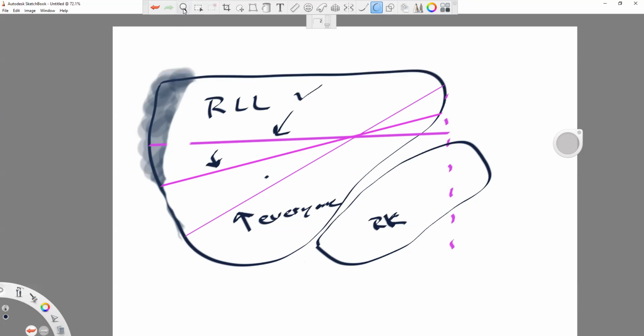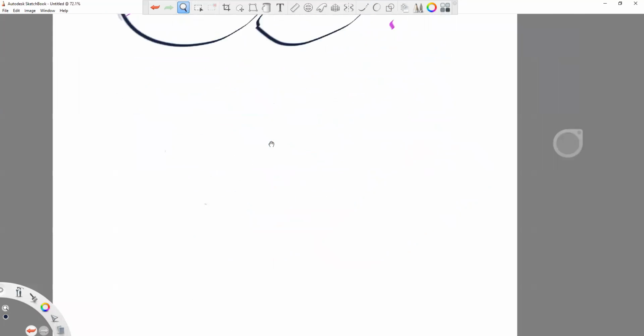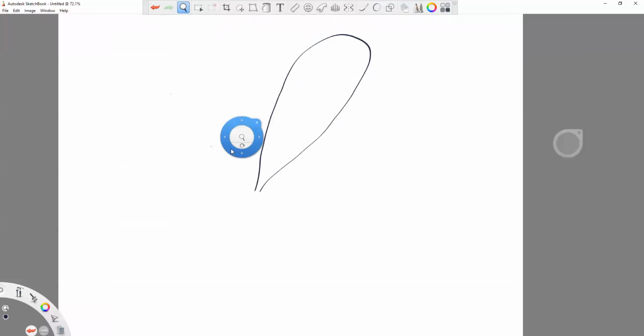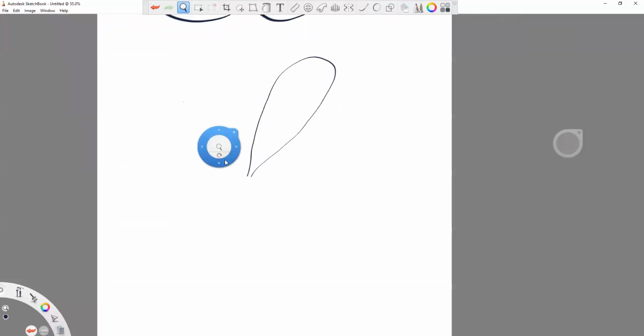So I was just thinking, wow, what else do we need to talk about? We need to talk about gallbladder, right? So sometimes you see the gallbladder like so, standing up. Once again, gallbladder is not really standing up. It's actually hanging downward.